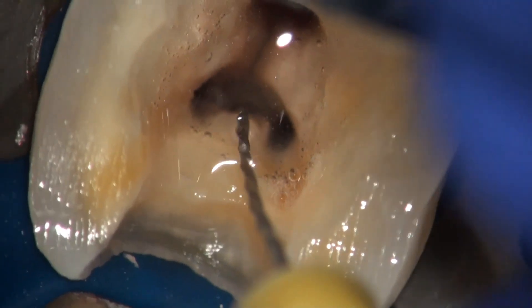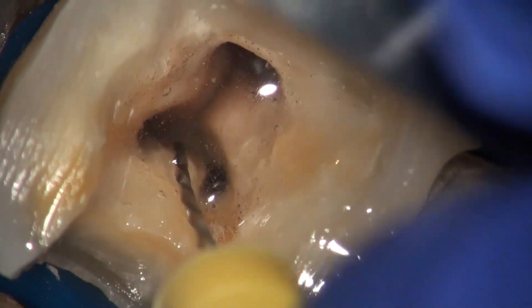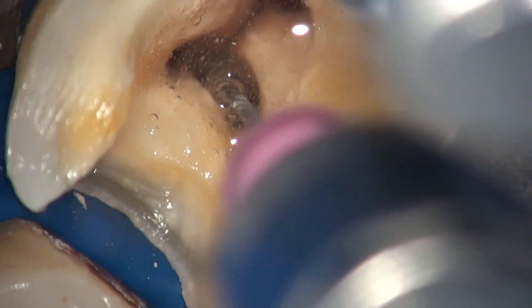Then we may use a very thin endodontic explorer or micro opener, for example, to scout the isthmus and feel for a tug-back effect. Here we can see the hand file — a C-plus file, number 10 — being used to probe this area.